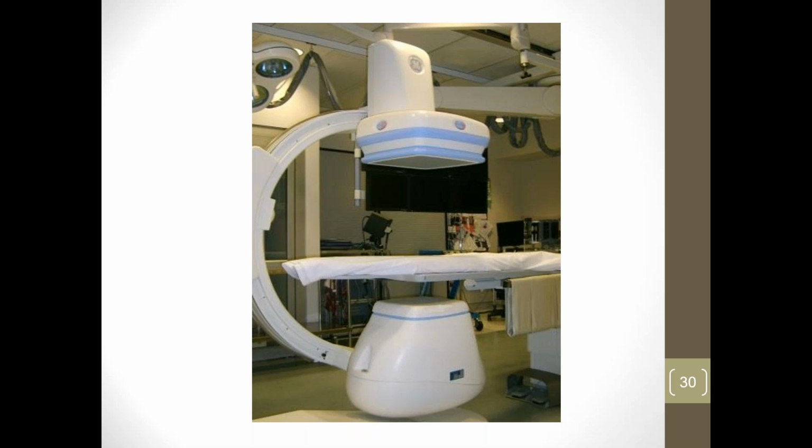Keep in mind, in a cath procedure, you're looking at somewhere from 15 to 30 frames per second. That's a huge amount of images and information that is instantaneously getting transferred from that pizza box back to the image processor. And now they have ones that go up to 60 frames per second. It just blows my mind that they're able to do that much imaging so quickly.